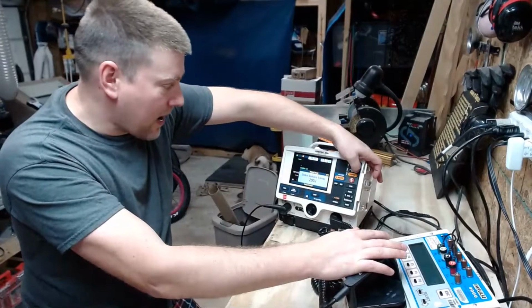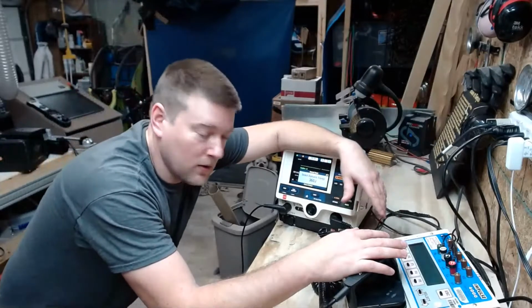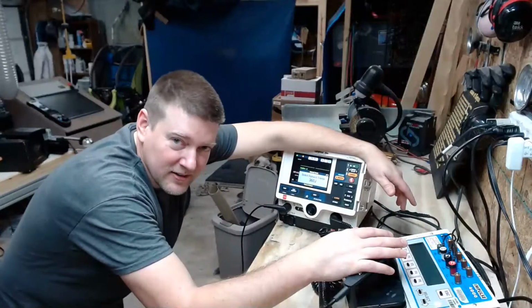So I'm going to go ahead and set the defib. Woo! Guys, I stand corrected. This is the first time I've been messing around with the LifePak 20e, and this guy does biphasic to 360 joules.